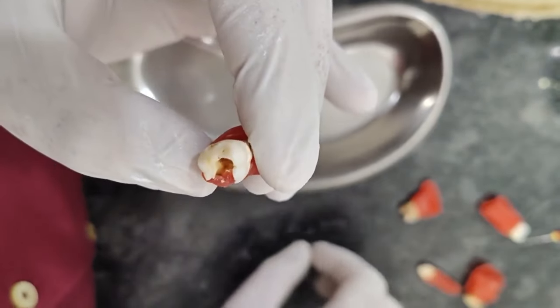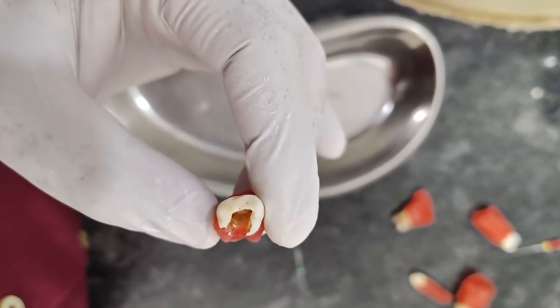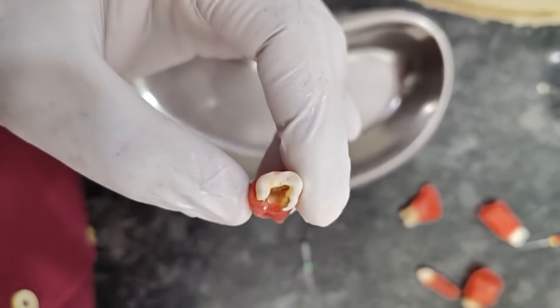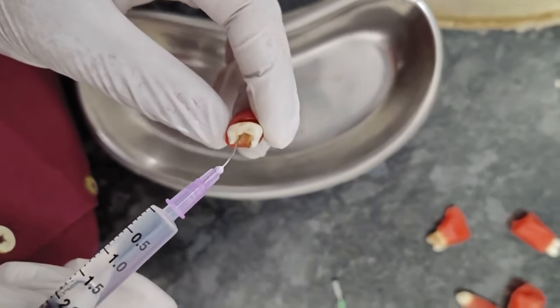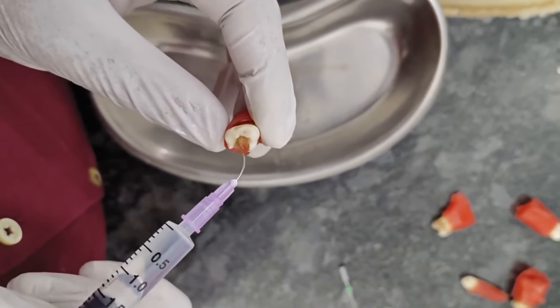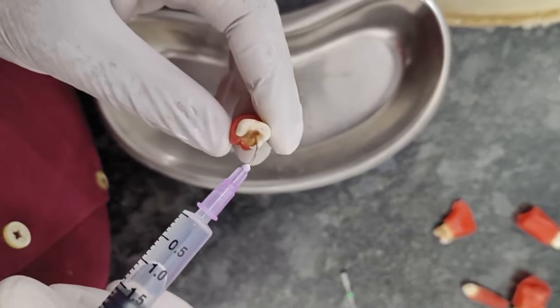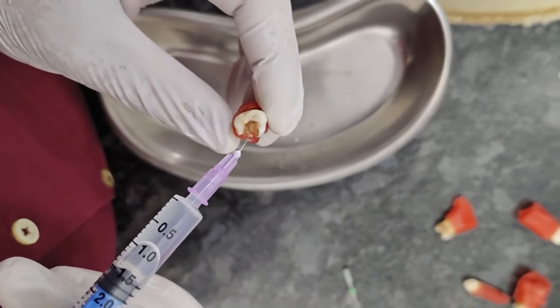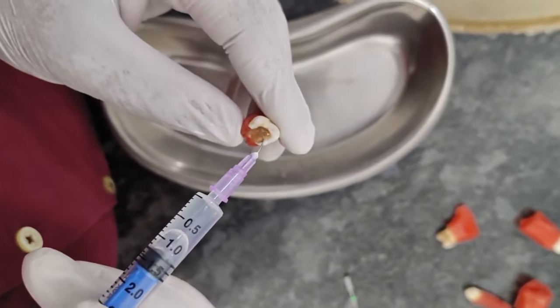Right. So what I would suggest, as I have suggested in the earlier videos, is that we have to do some coronal flaring. So now again we are irrigating it. We are irrigating it again after each filing in order to remove the debris. So now I'm irrigating with plain water. In the patient's mouth, you have to irrigate with sodium hypochlorite 5% by isolating the area.